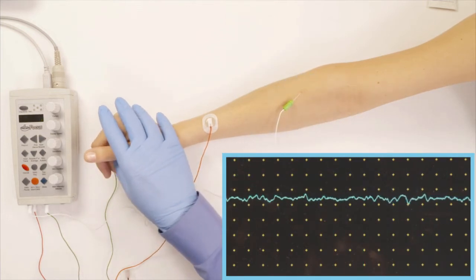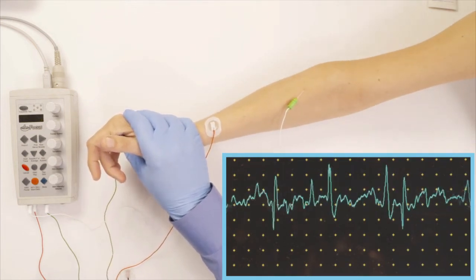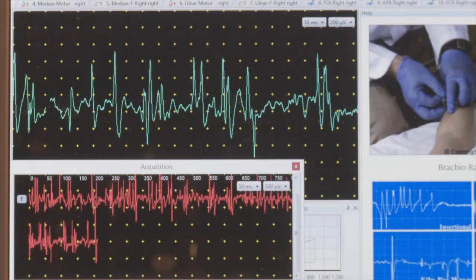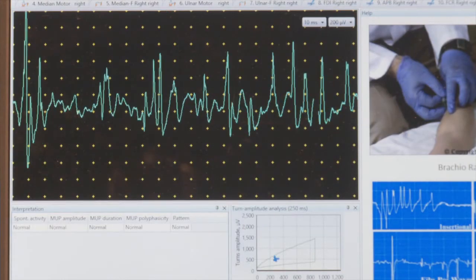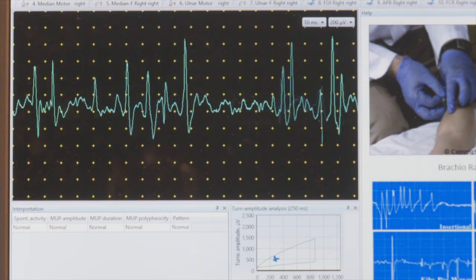And the next step is to have her activate the muscle a little bit. So raise up. Raise up some more. Here we go. As soon as it fills the screen, I stop.